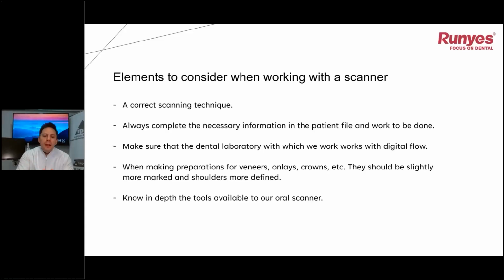The secret of scanning is that it should be dry, and all the edges of the preparation should be well marked. It should be dry and with no blood.